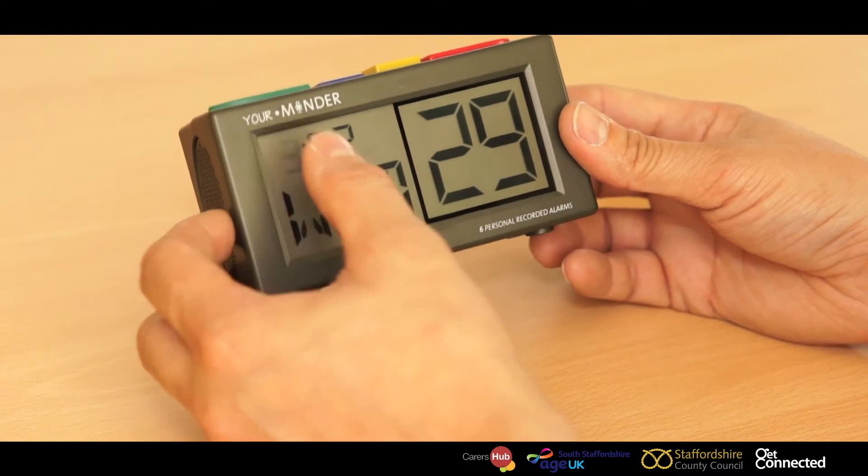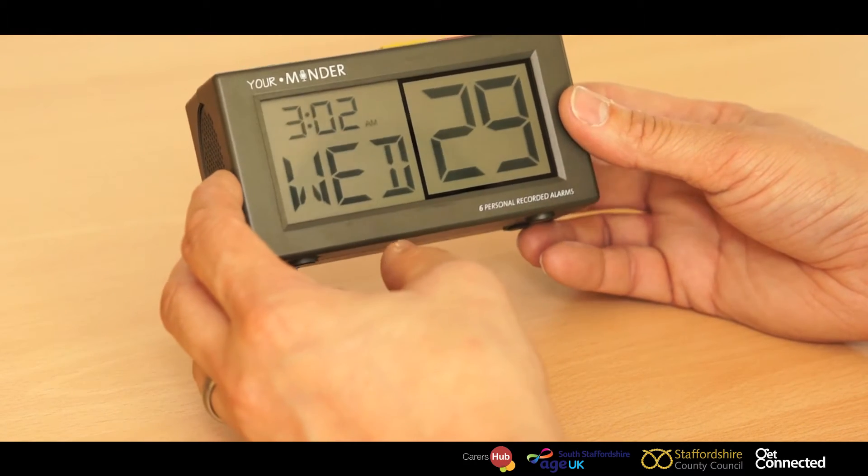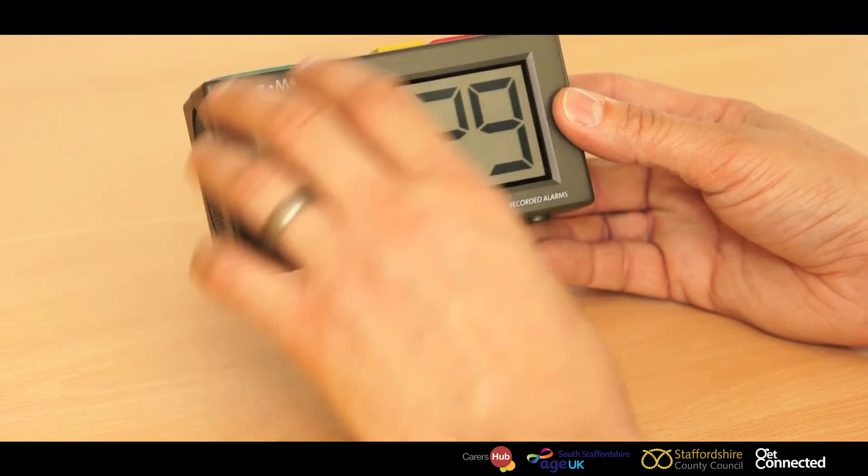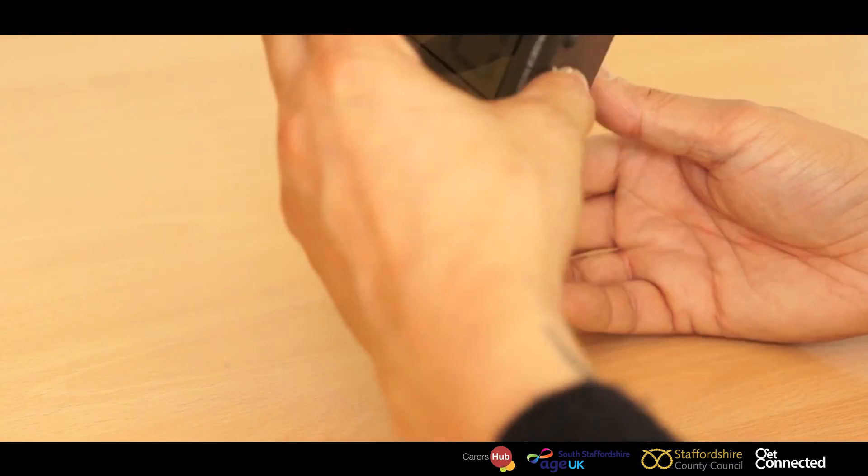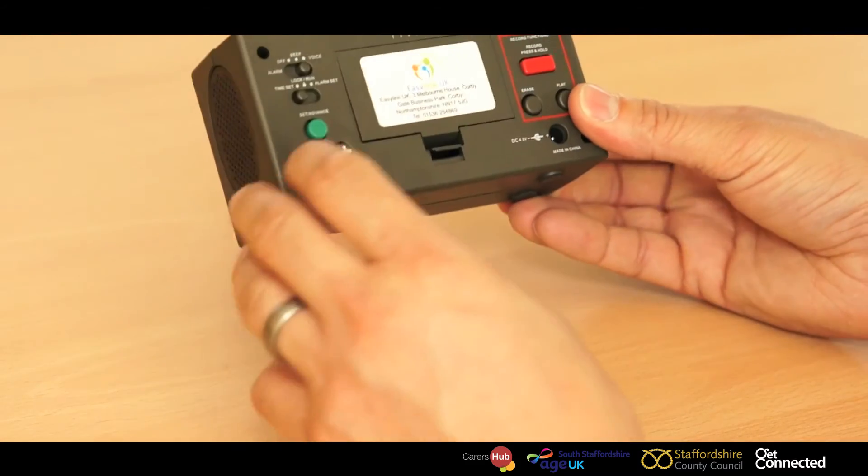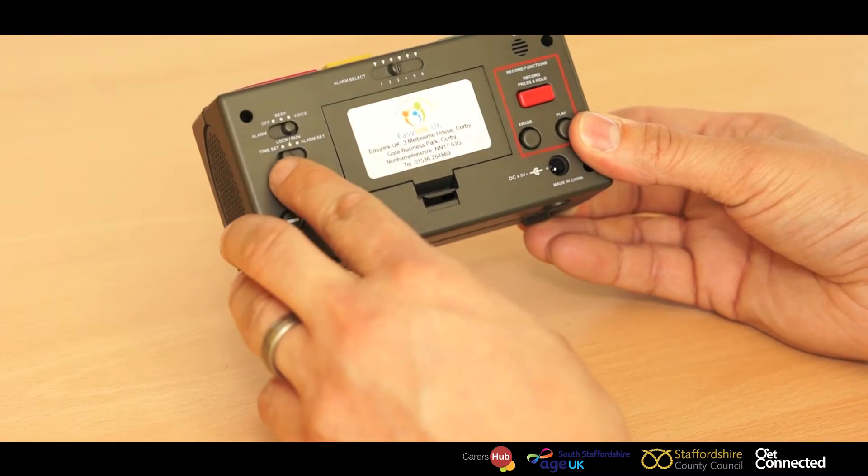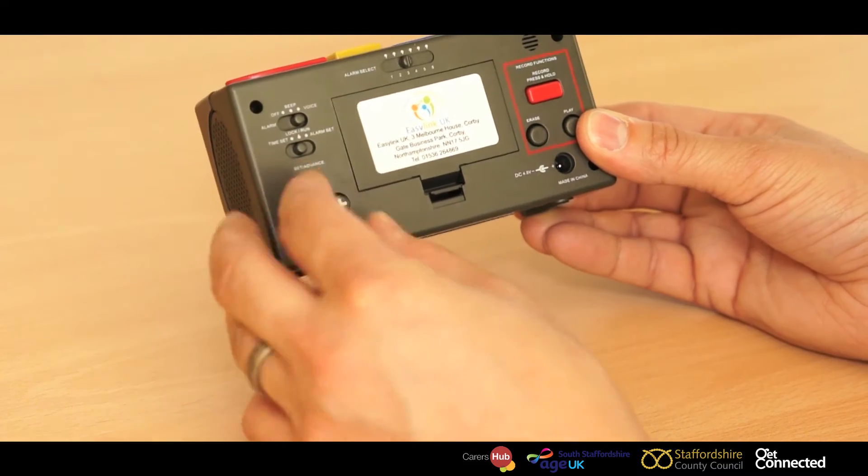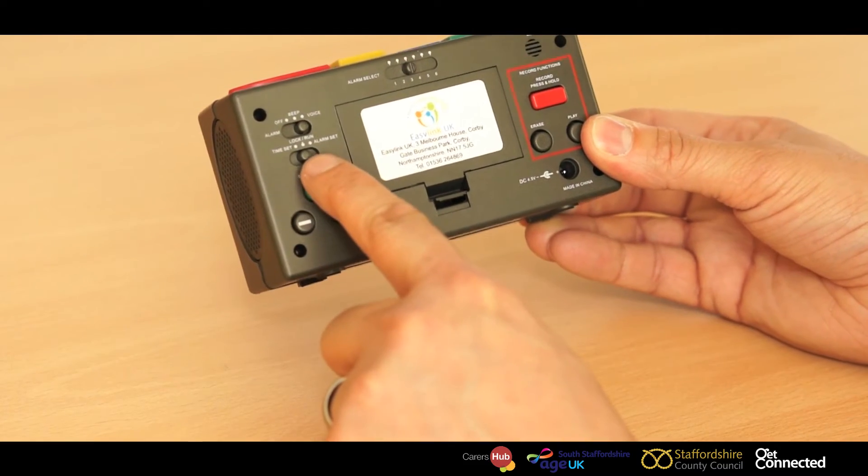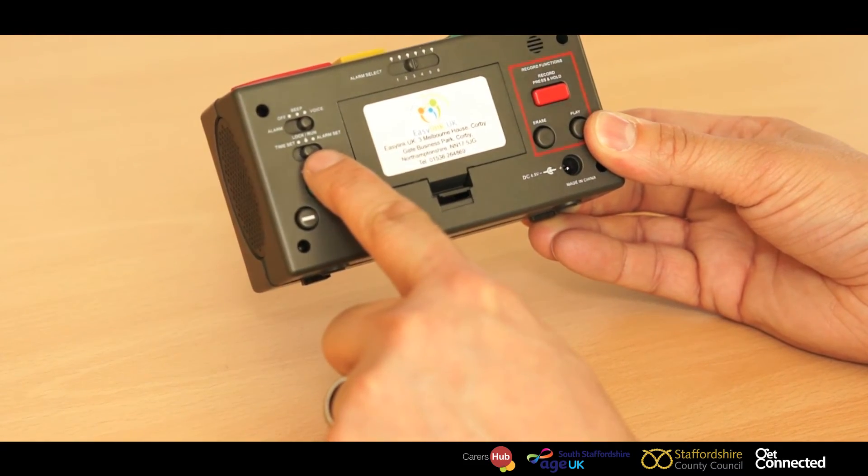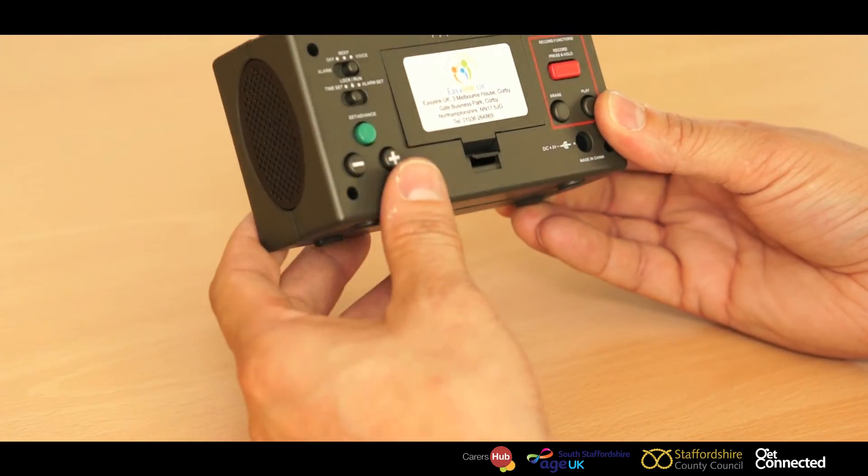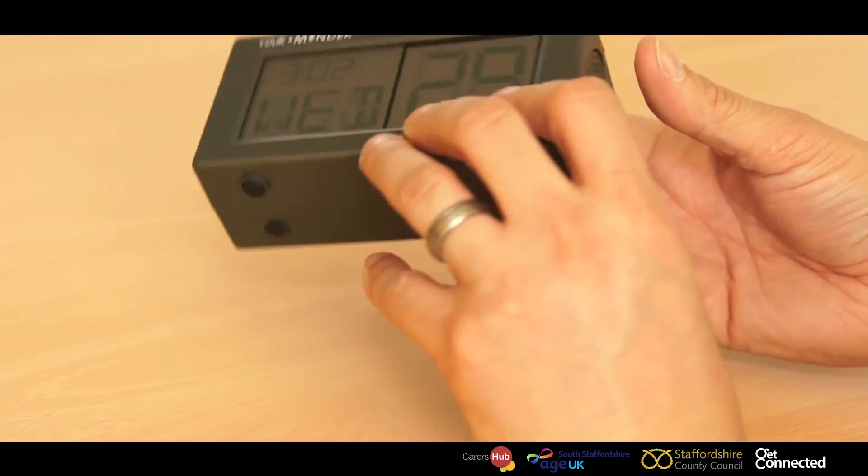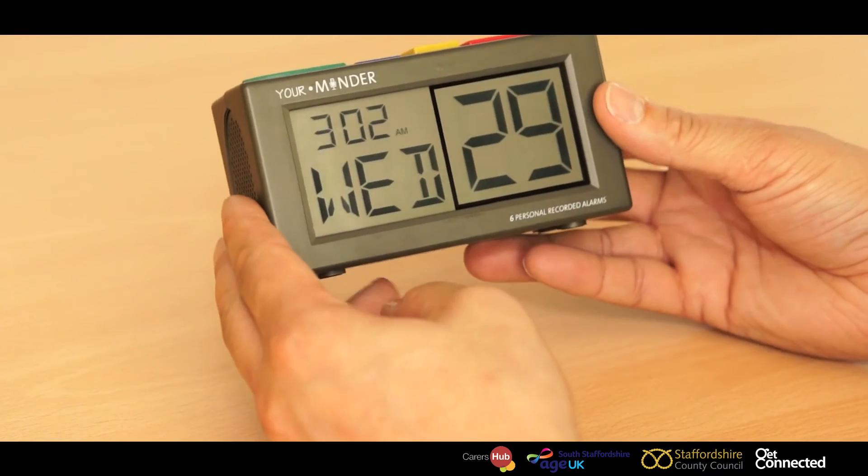Once you're happy with the date and time, then move the time and set button to the lock function, which is in the center. That time is now locked into position.